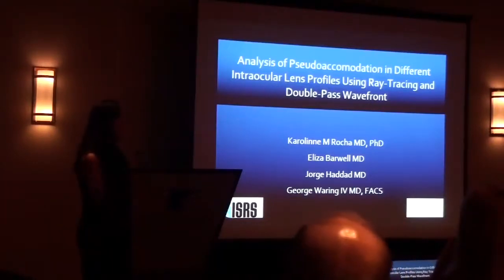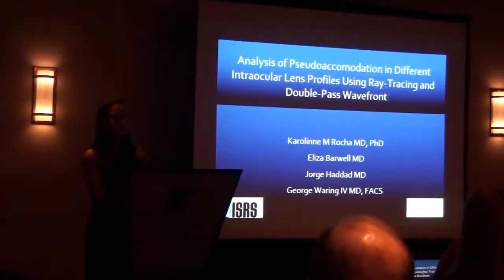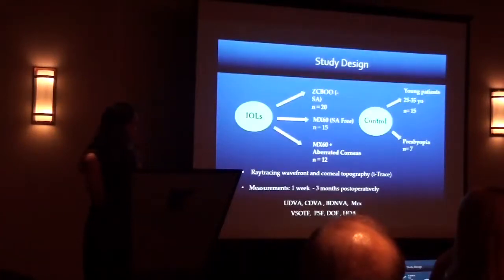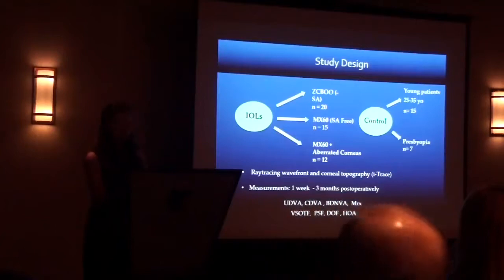Sorry. But basically, I just want to show one of the software programs, and this is a really nice study that we're doing with different IOL profiles. I want to thank my co-authors, and Dr. Haddad is here. But basically, in this study, we're looking at true accommodation versus pseudo accommodation.